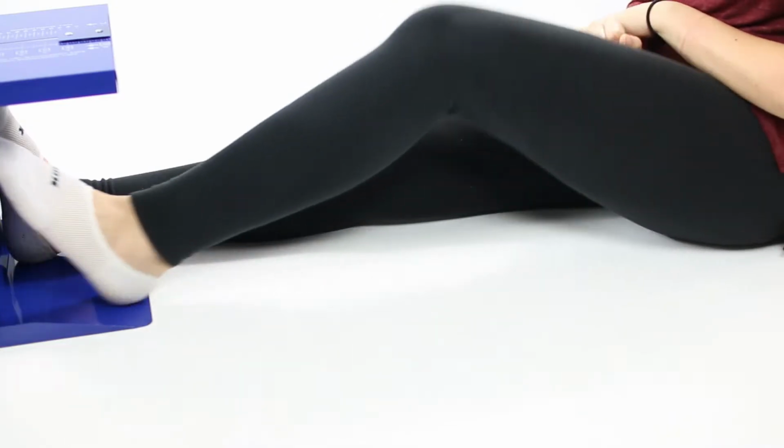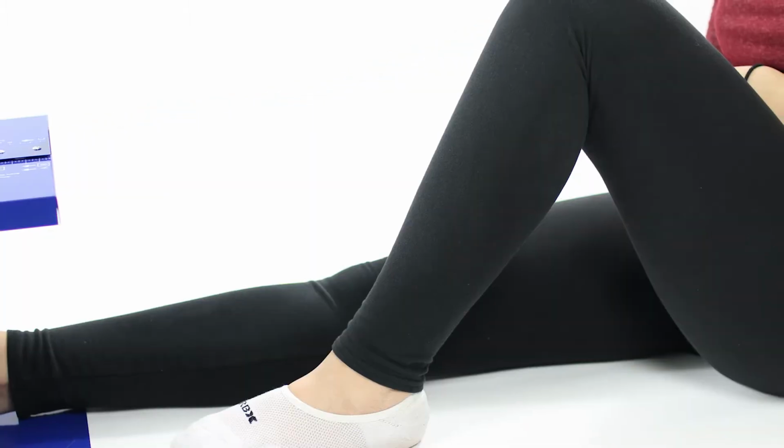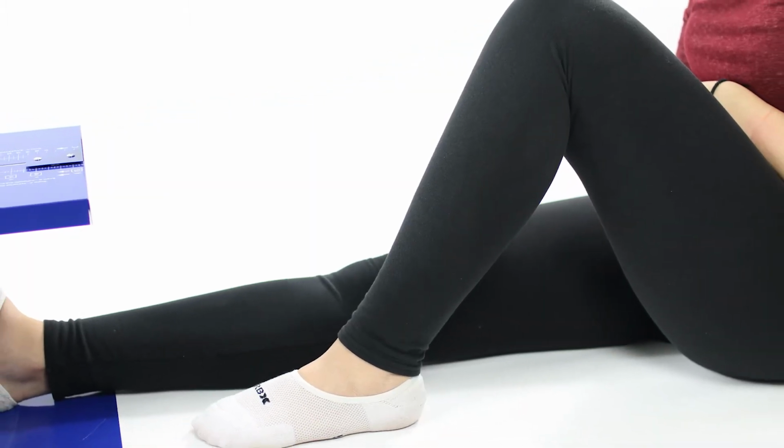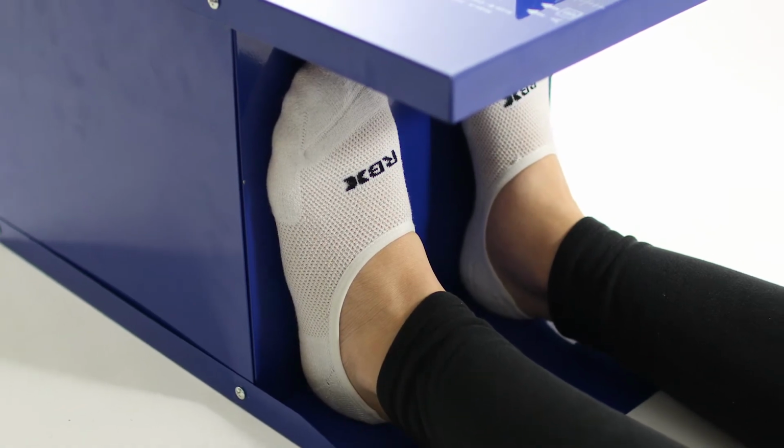Sit on the floor with your hips, back, and head against the wall. Extend your legs fully with the back of your knees touching the floor. For the back saver method, extend one leg and bend the other. The bottom of your feet should rest firmly against the foot plate.